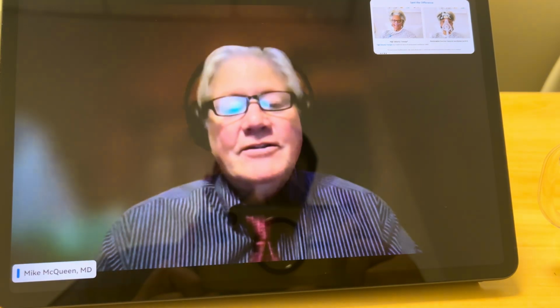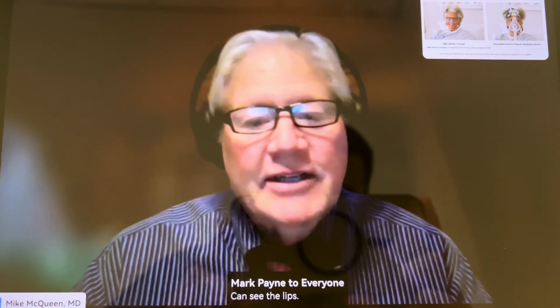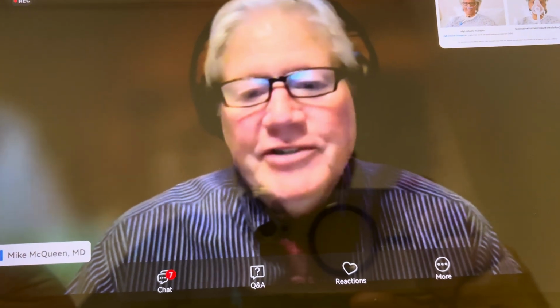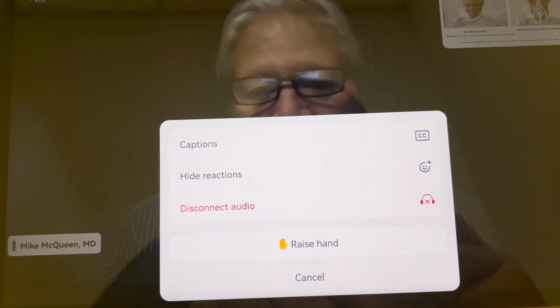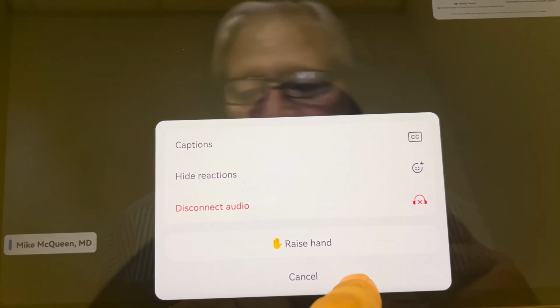Good. Yeah, I think there are clinical significant differences, and you guys have picked up on some key factors. The patient can wear her glasses. Because her mouth isn't occluded, she can speak to her provider and her loved one. She can also drink fluids, take oral meds, that kind of thing. And as Dr. Whittle pointed out, just overall comfort, not the soft tissue trauma or physical discomfort from the mask.